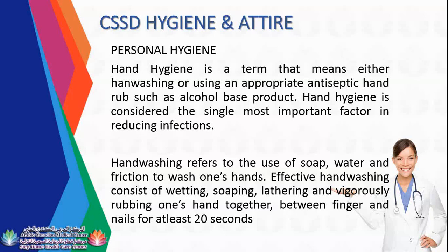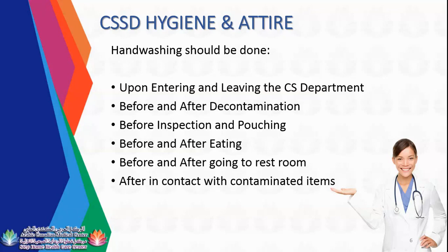Hand washing in CSSD should be done upon entering and leaving the CS department, before and after decontamination, before inspection and pouching, before and after eating, before and after going to the restroom, and after contact with contaminated items. So even if you are just handling, for example, a transport bin with soiled instruments, once you remove your gloves, you need to do hand washing. The reason why, you don't know if the integrity of your gloves is intact because sometimes there are small holes.